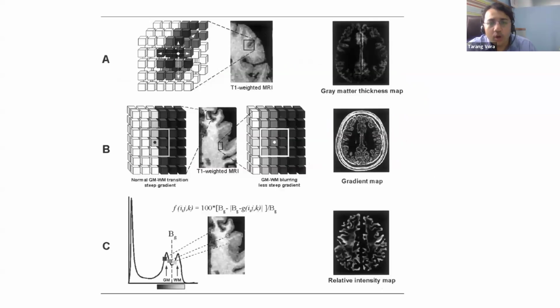Texture analysis means statistical or mathematical analysis which is done by the computer. It is not done by the human eye. What the computer can detect, the human eye cannot. The computer breaks down the signal from a T1 weighted MRI into multiple voxels. Like we have pixels, that is a 2-dimensional thing, a voxel is a 3-dimensional thing, as you can see the cube over here. The image on the left side is showing cubes. This brain image is broken into millions of voxels.